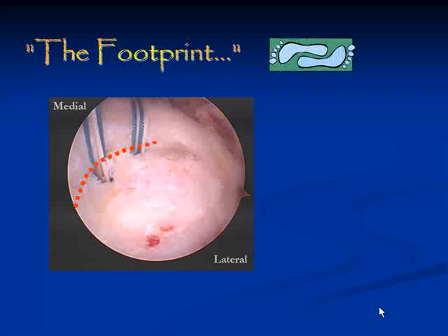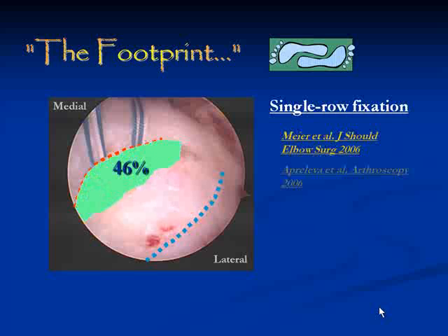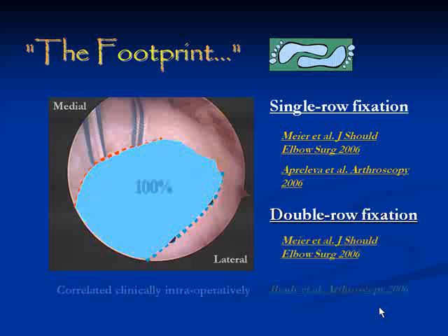If we look at some of the original studies, we learned that the insertional site for the supraspinatus is actually a very broad area, measuring about 14 millimeters from medial to lateral. And with a simple single row fixation technique, we can restore only about 46% of that original footprint area. Whereas with a double row anchor technique, it is possible to fully restore 100% of that original attachment site.